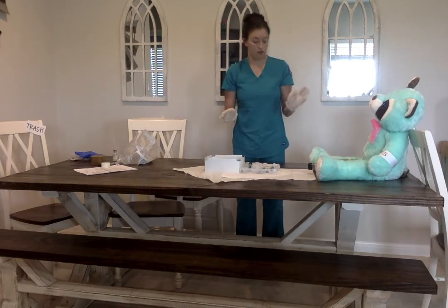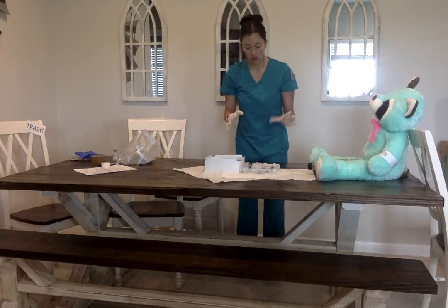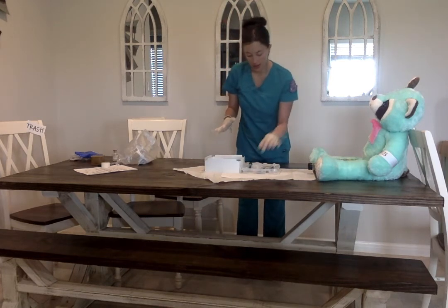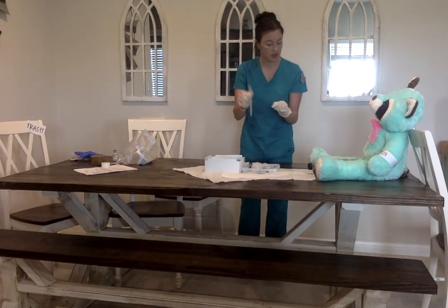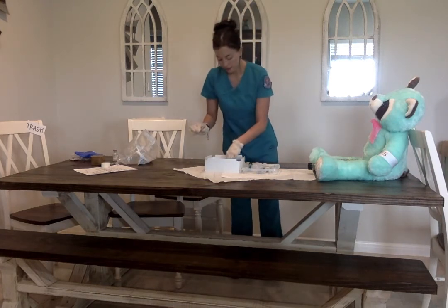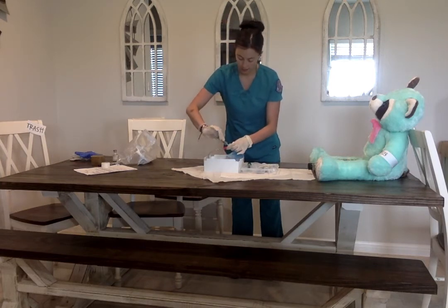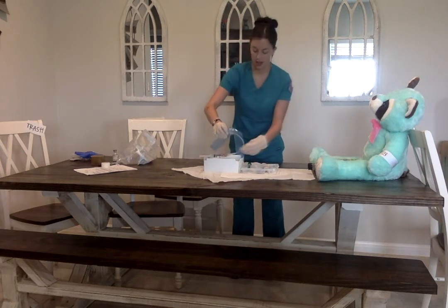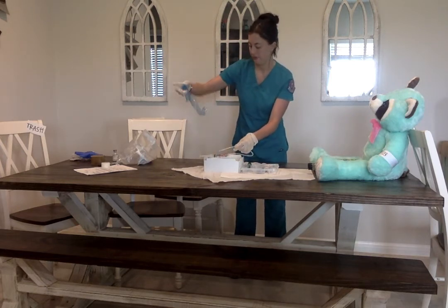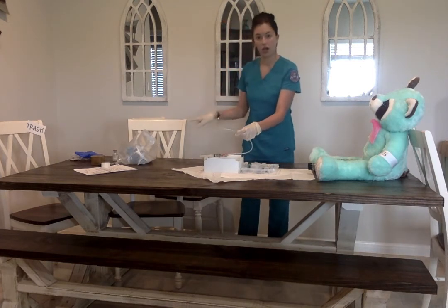Alrighty, so now I'm going to attach this water syringe. It's pre-filled with 10 mL of water. And I'm going to take this off and put it in the trash.